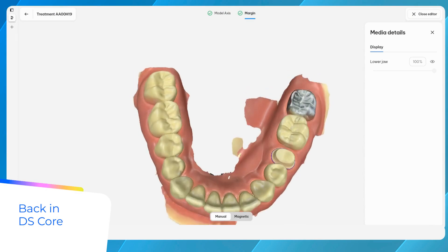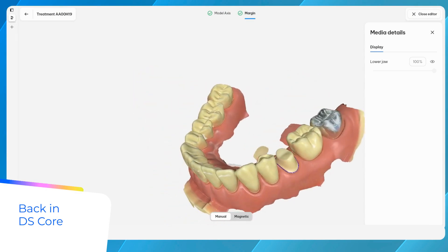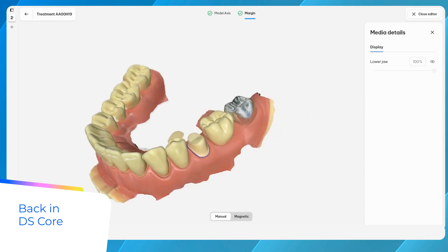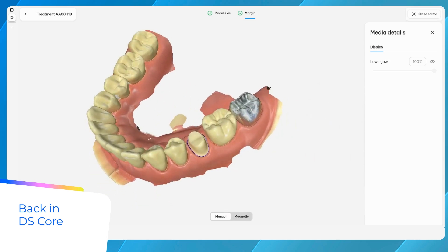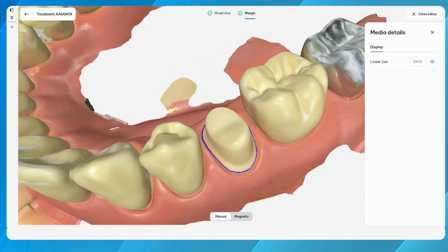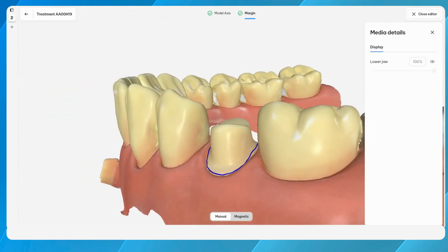The DI and CAD-CAM connector facilitates the immediate upload of the file and displays the scan in the viewer on your DSCore workstation. You are now ready for the next step: defining the margin.